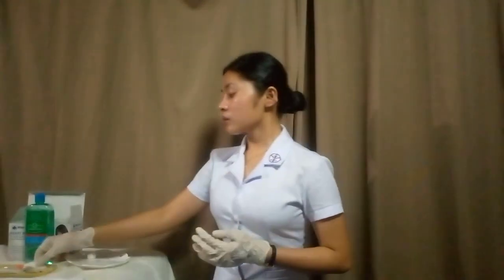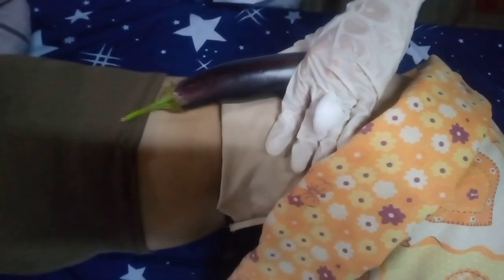And now, hold the gauze pad between the third and fourth fingers of the non-dominant hand and uncap the syringe, and hold the syringe between the thumb and forefinger of the dominant hand as if holding a ballpen. Place the ulnar side of your non-dominant hand just below the injection site and hold the patient's skin laterally about 1 to 1.5 inches. Hold the position until you center the needle.